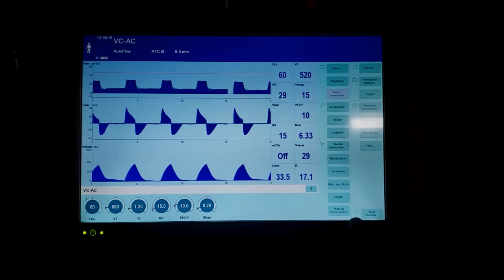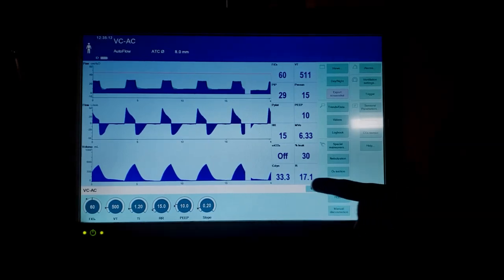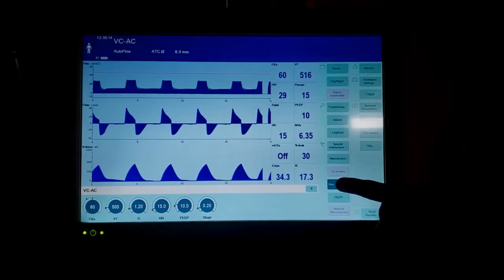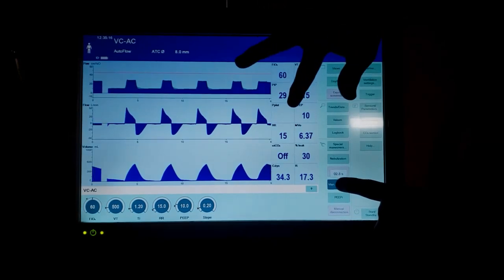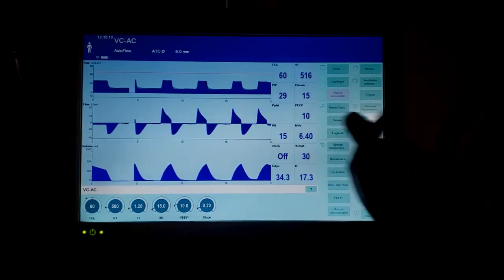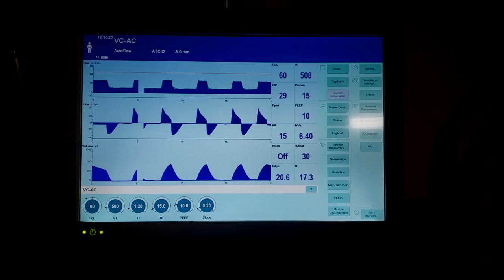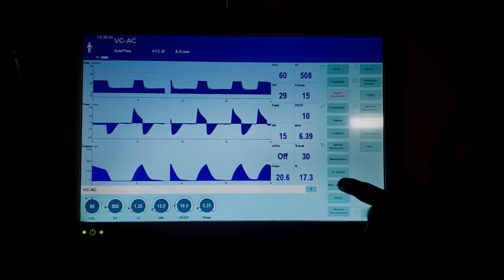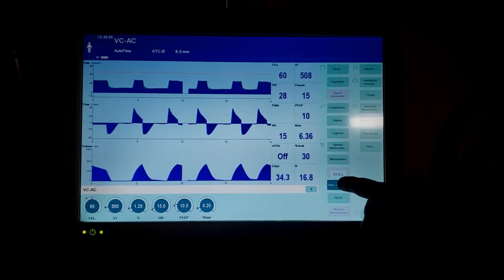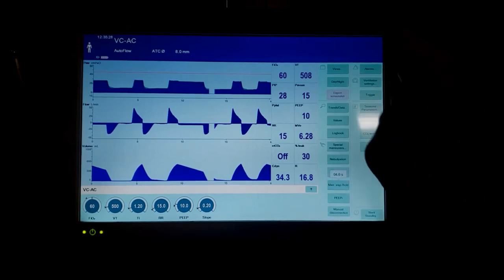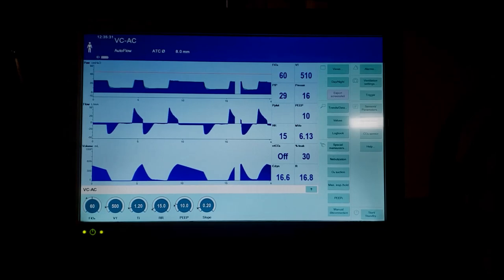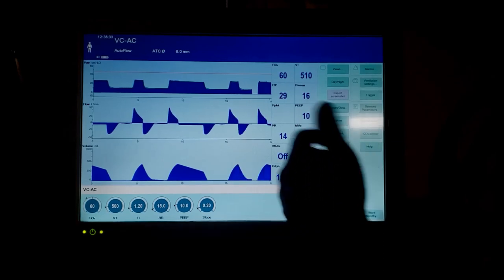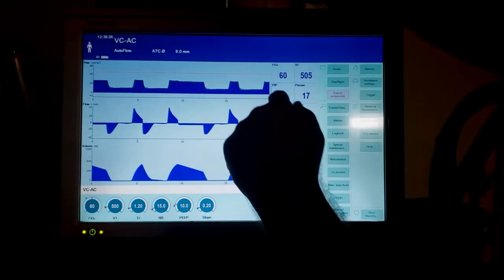This is going to monitor their plateau pressure. You'll see the next breath we'll get a plateau pressure. Hold, hold, hold, hold, hold, let go.